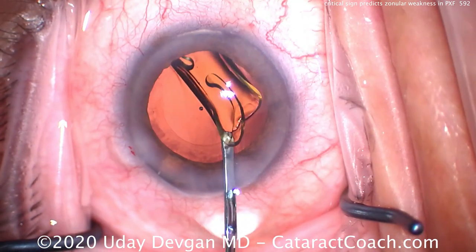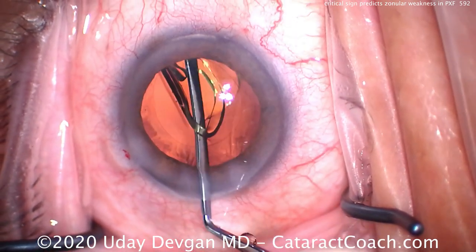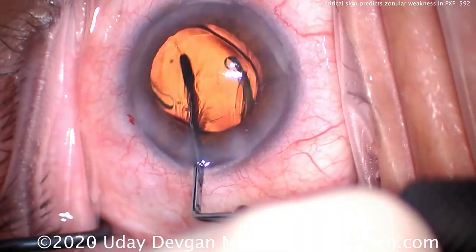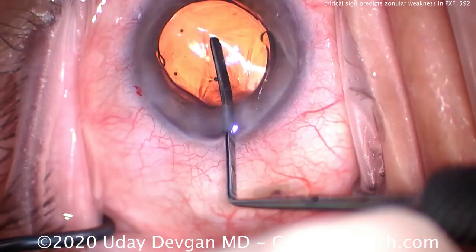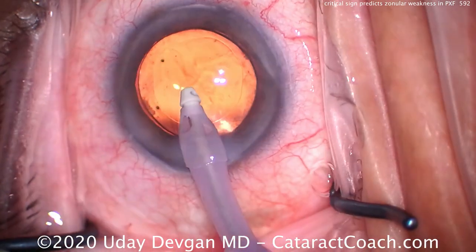We're putting a single-piece acrylic lens in the capsular bag — it goes in quite nicely. We'll do a little polishing of the anterior lens capsule to remove cells from the undersurface of the anterior capsule rim, which should help somewhat in preventing capsular phimosis in the post-op period. That looks great — we can see a five millimeter rhexis.